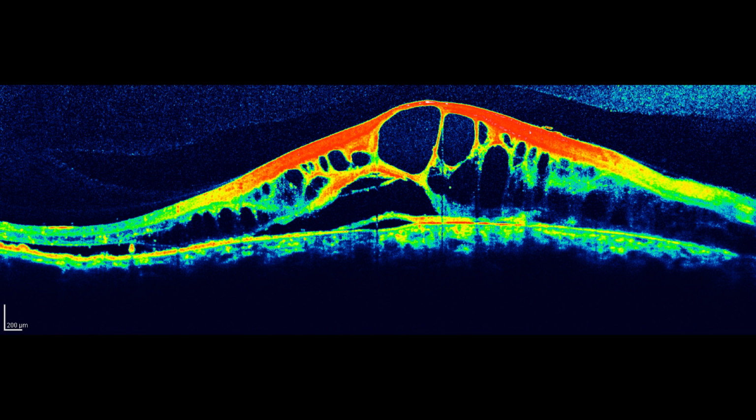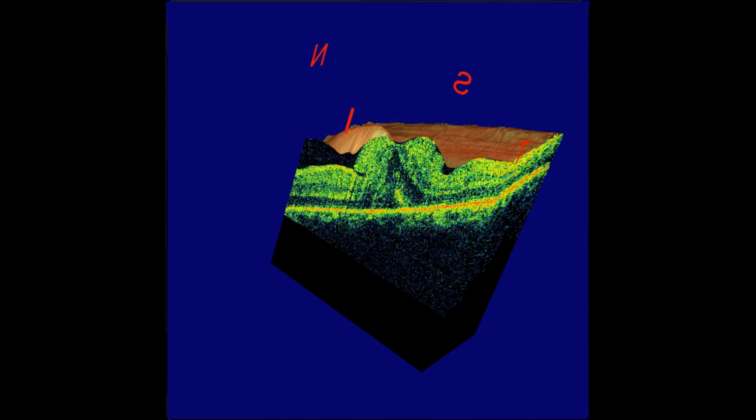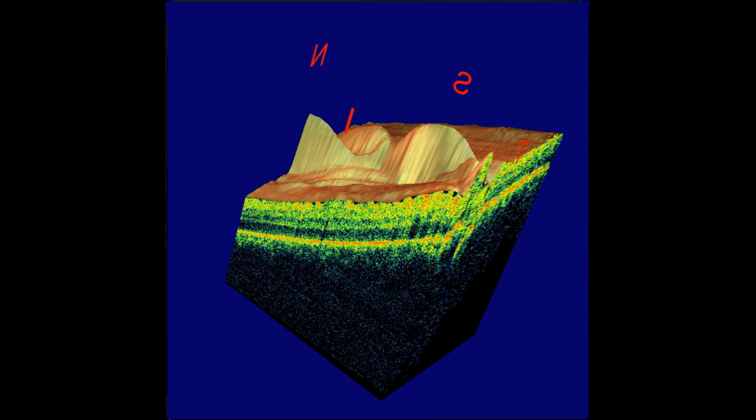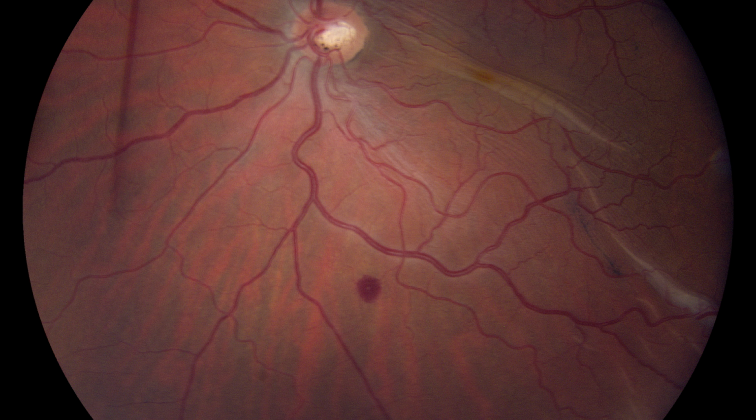And then these are some that just don't fit any of the categories that well. This is a patient with chronic central serous. Again, a diagnostic dilemma in 2008 or 9 when I first saw this patient, and then the OCT was helpful there. This is a patient post-op, thankfully not my post-op. And of course, I did just cause one of these a couple weeks ago, but not through the macula. This is a macular fold, and here's a picture of it. I had a hard time fixing that.